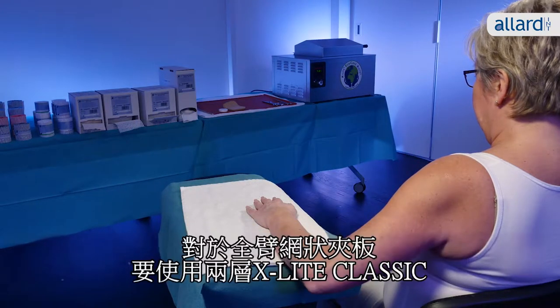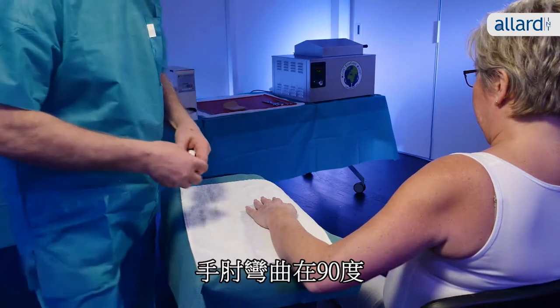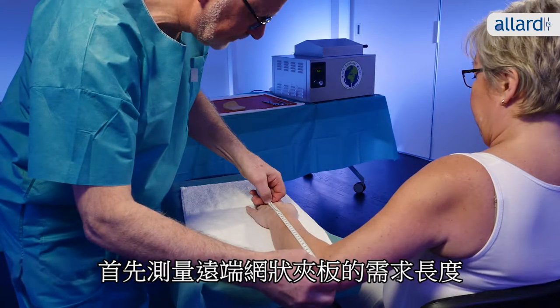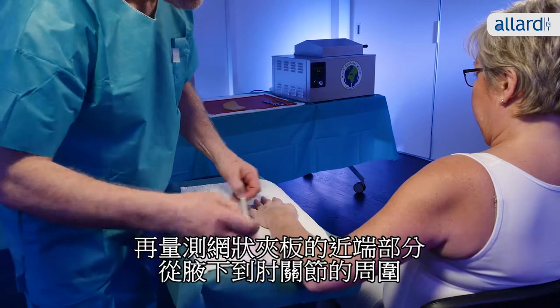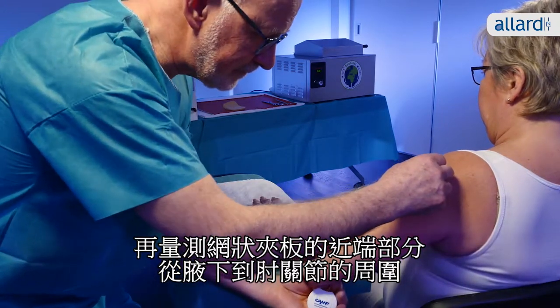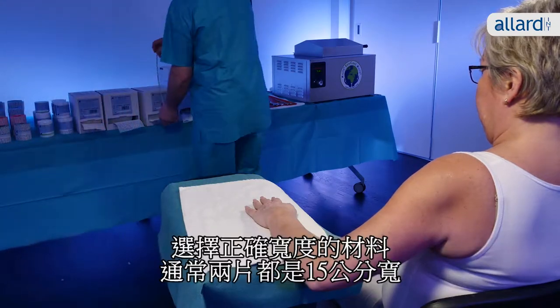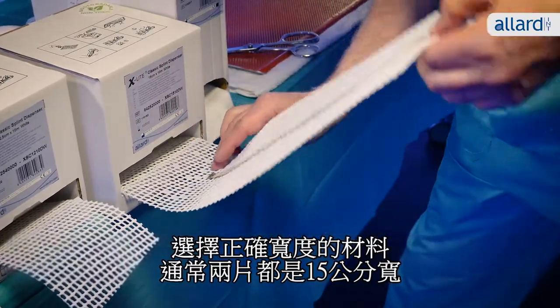For a full arm splint you will typically use two layers of X-Lite Classic. With the elbow at 90 degrees, start by measuring the desired length of the distal part of the splint from the metacarpals and around the elbow. Measure the proximal part of the splint from the armpit and around the elbow. Choose the correct width of the material, typically 15 centimeters for both pieces.